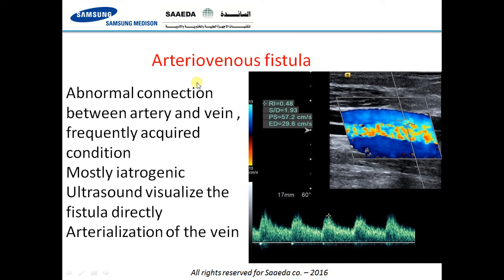Another vascular pathology causing lower limb pain and swelling is arteriovenous fistula — a direct connection between an artery and a vein. The vast majority are caused by iatrogenic intervention during catheterization, though arteriovenous fistulas are also deliberately created for hemodialysis in renal failure. On imaging, you will see either direct communication between the artery and vein, or arterialization of the vein — a vein that has all the Doppler criteria of an artery, with the same pulsation, velocity, and direction as the adjacent artery.